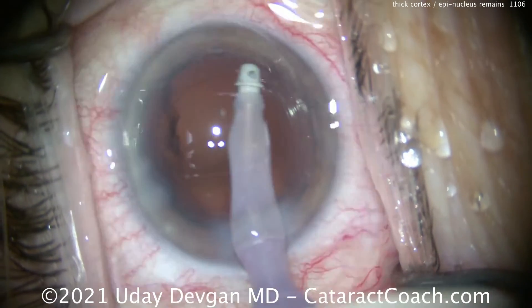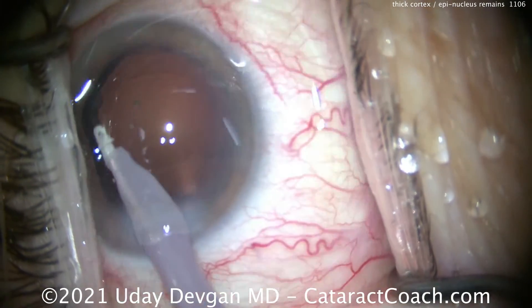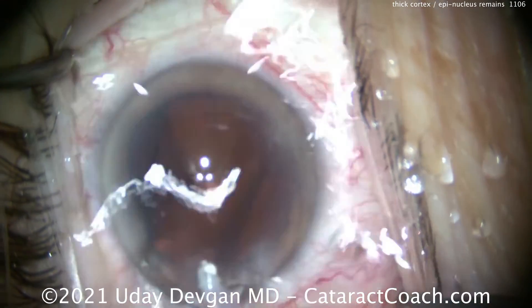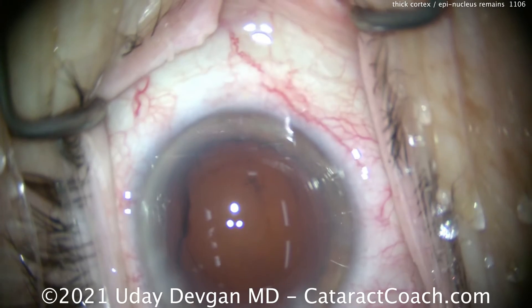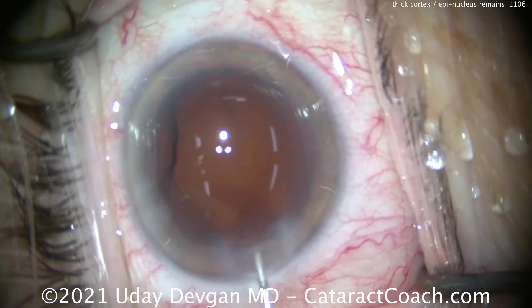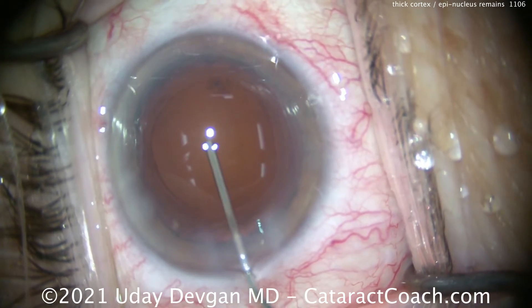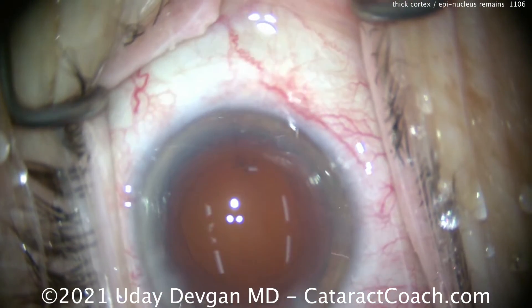Now we've got it out. Let's polish up that capsular bag, the undersurface of the anterior capsular rim. That looks pretty good. There's a little bit of viscoelastic there, but now we've got a nice, clean, empty posterior capsule or capsular bag. If you look through the posterior capsule, you can see there's some vitreous opacities, vitreous floaters. There's that viscoelastic going inside the eye. That all looks pretty good.